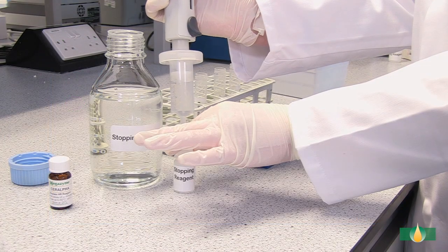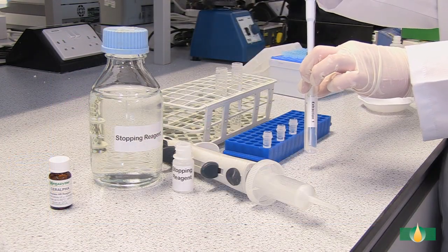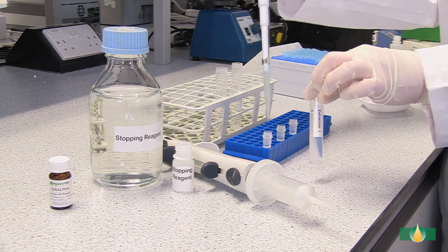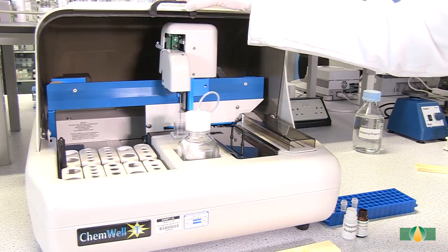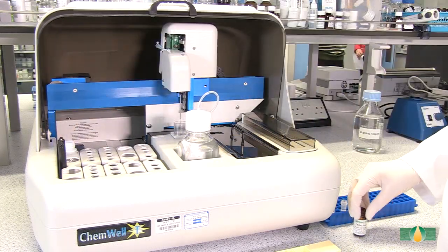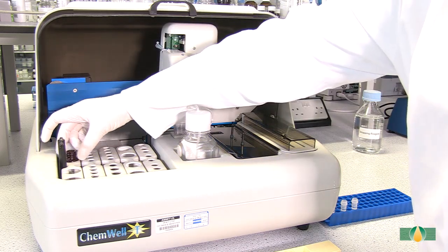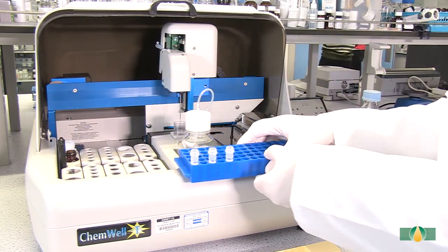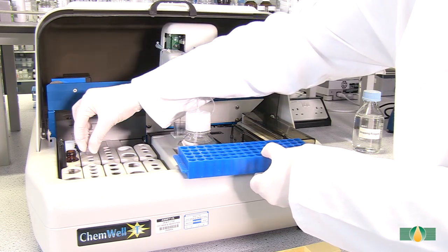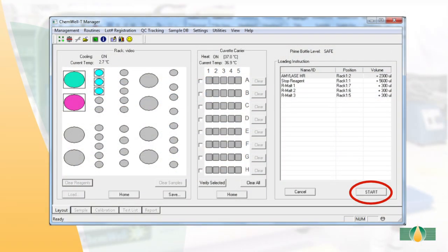Transfer the reagents and sample extracts to appropriate containers compatible for use with the ChemWell-T autoanalyzer. Ensure that samples and reagents are placed in the correct positions according to the layout, and that clean empty cuvettes are available and loaded correctly. Then select start from the layout tab.